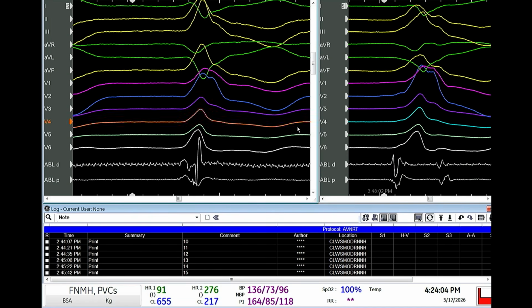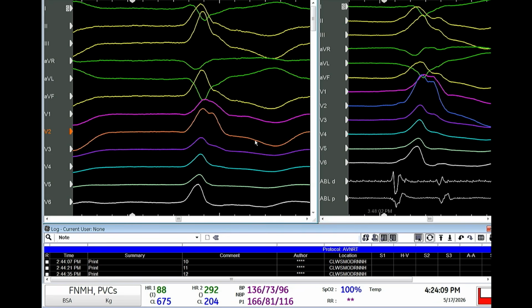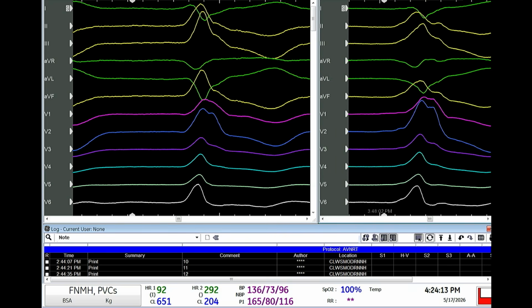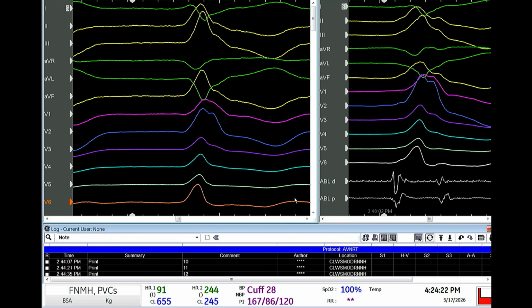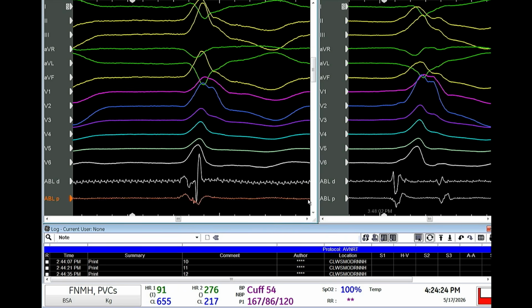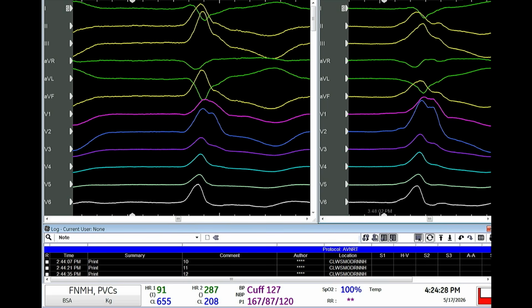Yeah, all the way up? Okay. Perfect. The other one too? Yeah. Okay, you can see here the main 2 flavors of the PVC. Now, you could argue they're a little bit different, just because of, just go up to the 12-lead. No, just the 12-lead EKG, please. Okay, so they're a little different just because of the width, but in general, they look pretty similar.